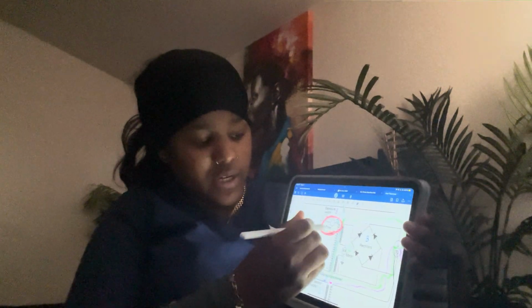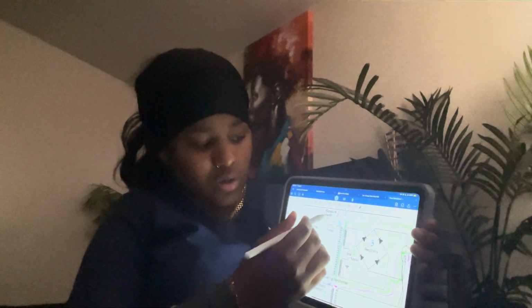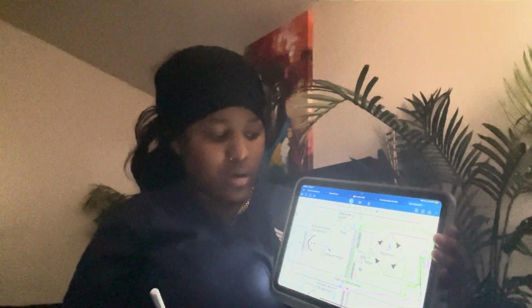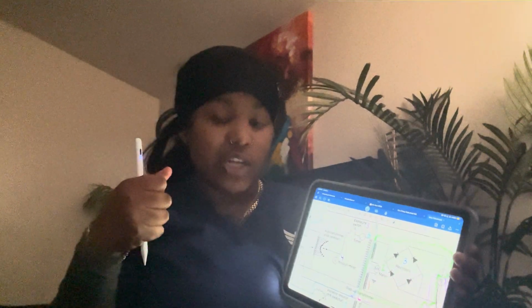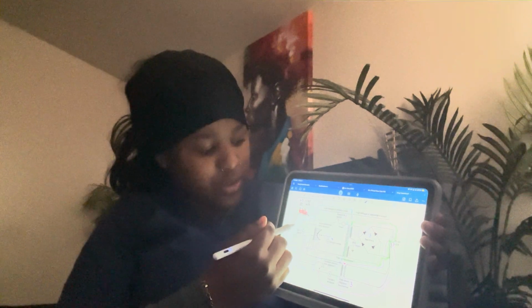So the X-ray timer is also determined by the exposure switch. The timer allows us to know how long it is going to be set, so that we know how long that electricity is going to flow through to get that exposure. That goes through with the seconds, like 0.3 seconds.